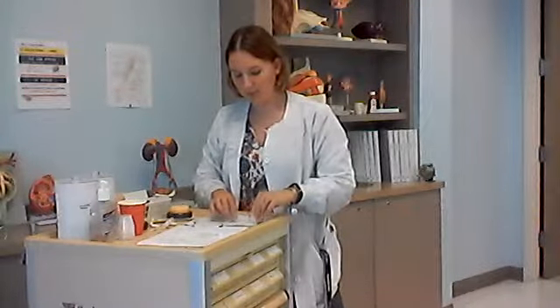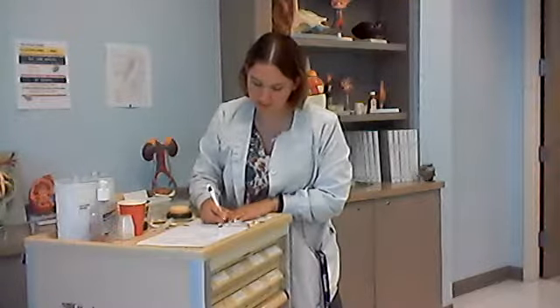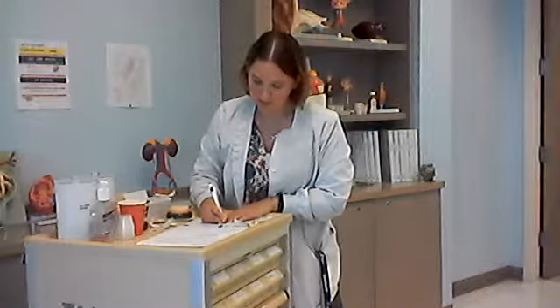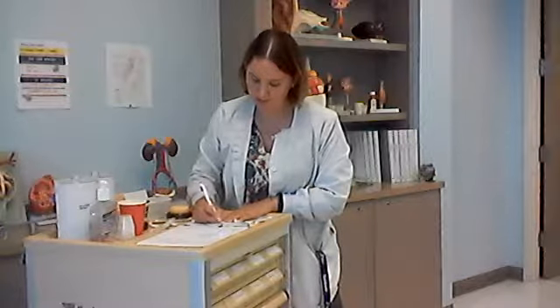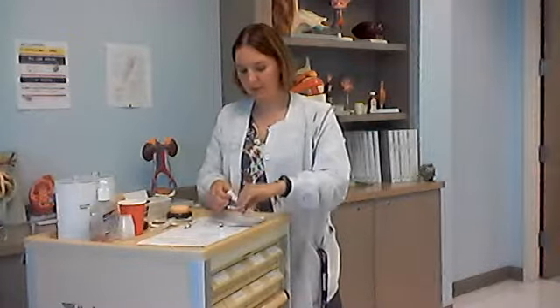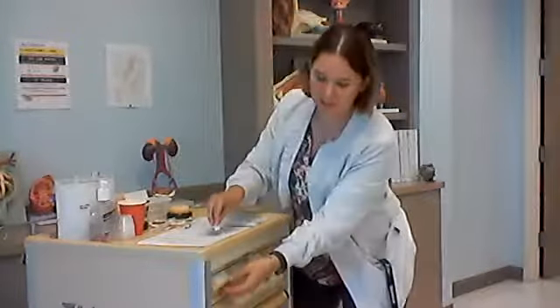Safely recap one-handed, and do my second check as I label my medication. So Terrence Walker, patient, 15461, medication, tuberculin, dose, 0.1 milliliters, route intradermal, time is now. Now I'll document it for you. Now I'm going to put my medication away. Never leave medication out on your cart.